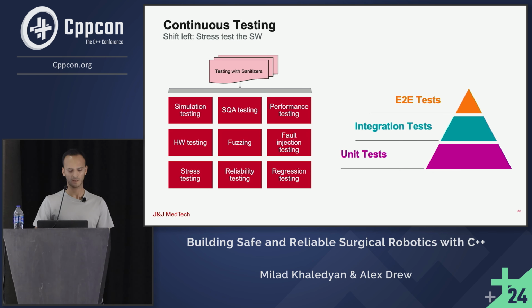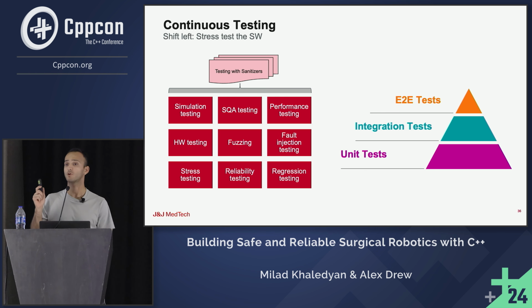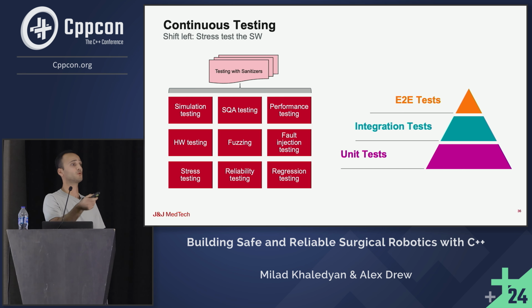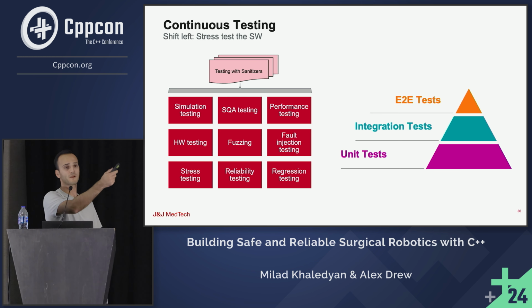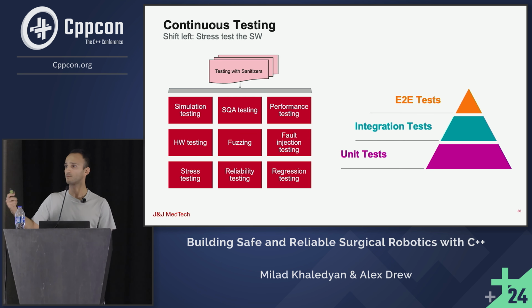I talked about testing a little bit. Testing, documenting testing, and compiling tons of reports on testing is extremely important. For example, from a cybersecurity perspective, you have to have fuzzing. You have to have penetration testing, which is extremely important on the cybersecurity side, both from a hardware and software perspective. A lot of the time people only do it in-house using their own development or cybersecurity team, but that's not actually enough. You have to have unbiased penetration testing from third-party vendors to come in without any bias and check your code from 0 to 100, both the hardware side and the software side, to ensure most of the vulnerabilities are actually addressed.